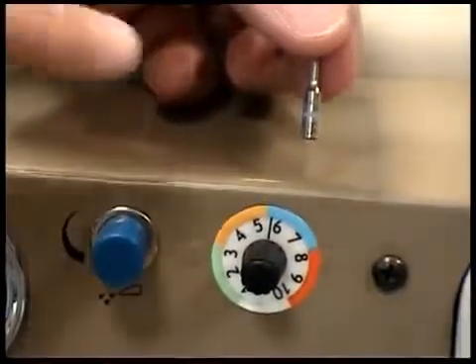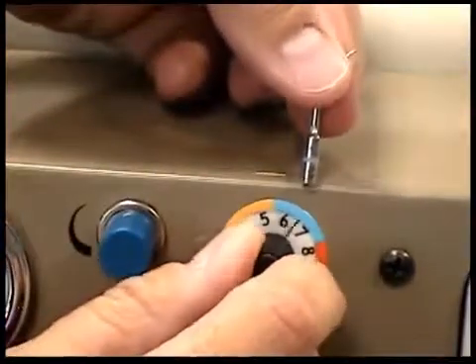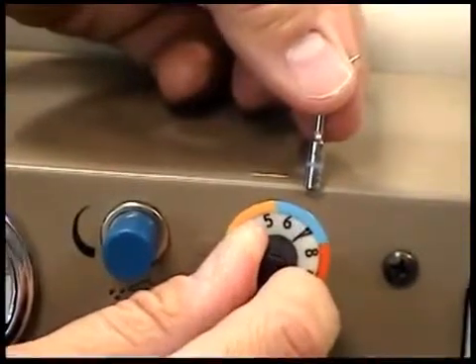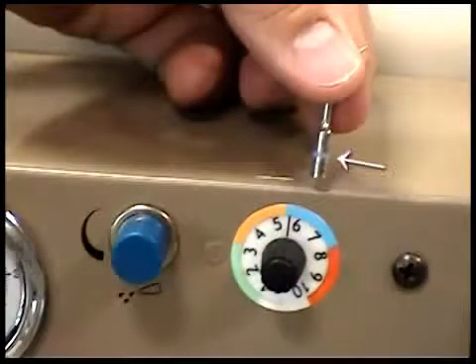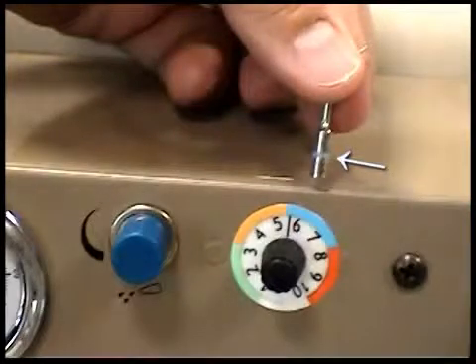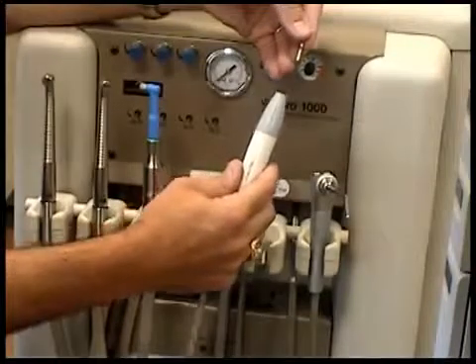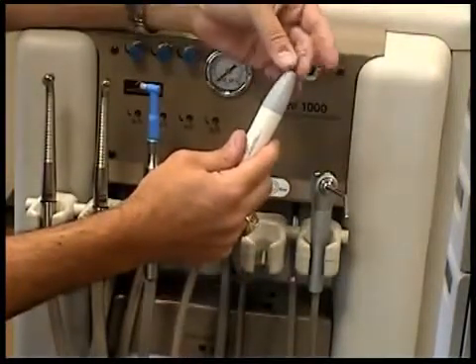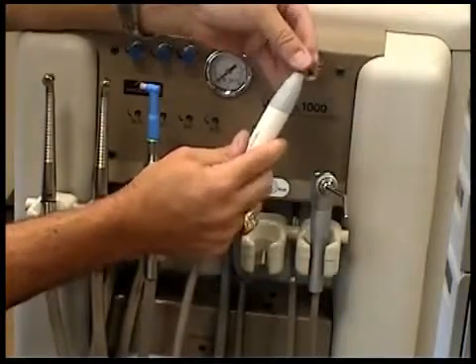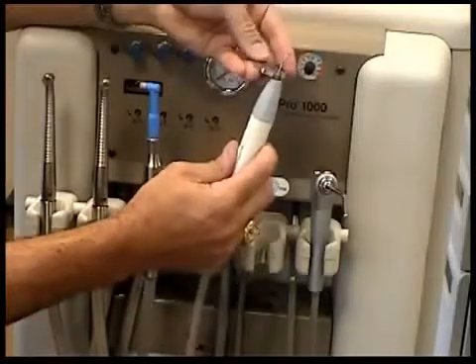Notice the color bands on the tips available for the scaler. These colors correspond to a range of possible frequencies available for a specific tip on the scaler. Always match the color of the band on the tip with the frequency range band color on the front of the unit. Screw the scaler tip into the handle. Prior to use, tighten the tip using the key tool that's shaped like a stop sign.